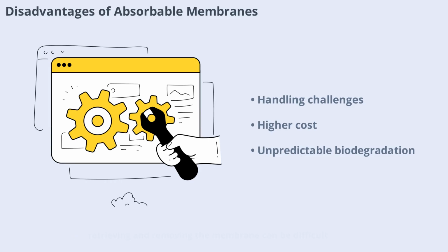In cases of infection, retrieving and removing the membrane can be difficult, as it may have already begun to disintegrate at varying rates. These factors must be considered when selecting the appropriate membrane for each patient.